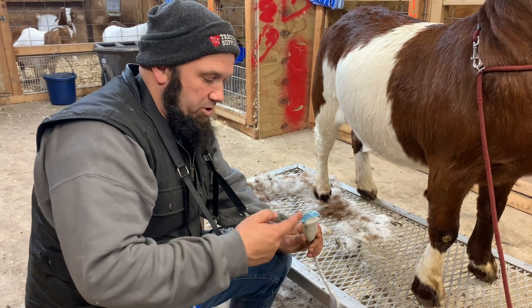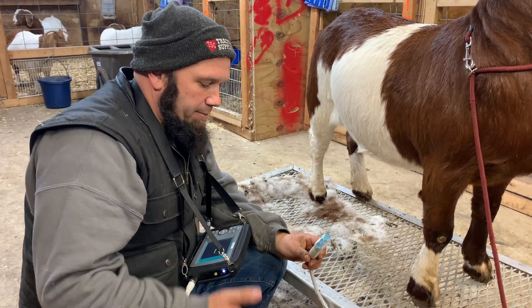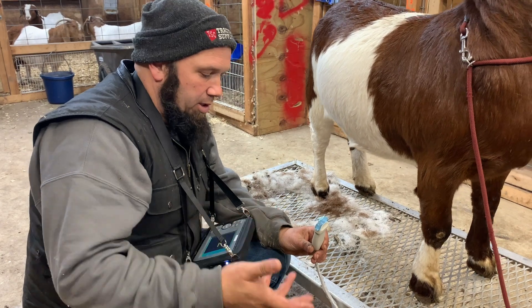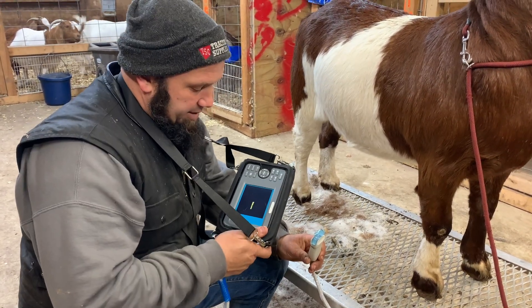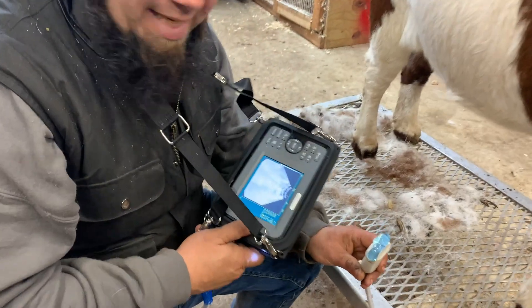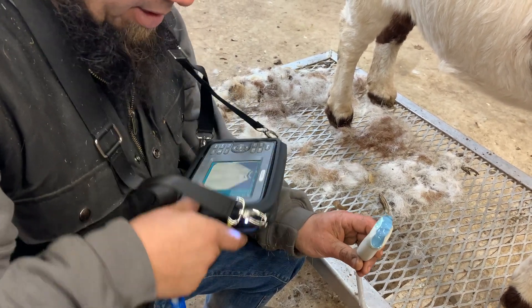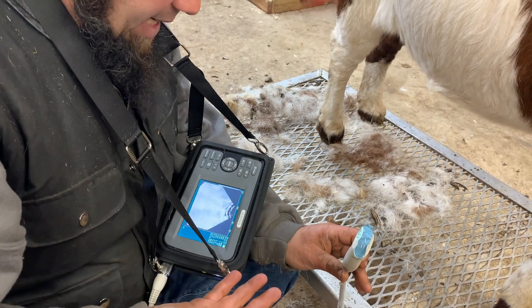So we got the ultrasound gel on here and we'll put this up on her. You can actually use alcohol or sanitizer or something like that instead of buying the actual gel. This is the actual ultrasound machine — it's pretty easy to operate. As you can see, this is all white here on the screen. All we had to do is turn it on; there's a little button on the side and it's ready to go.